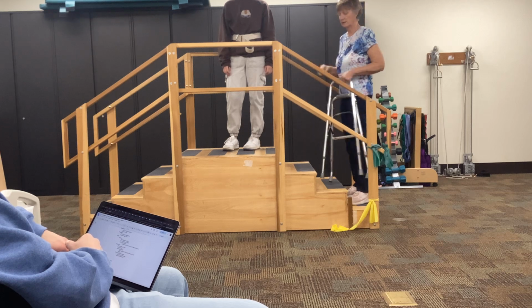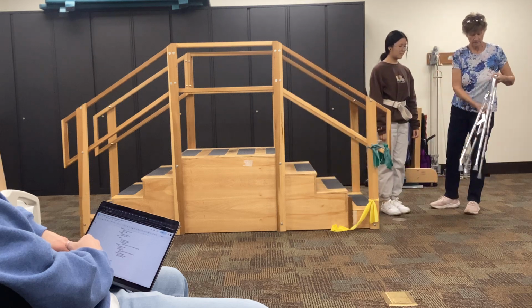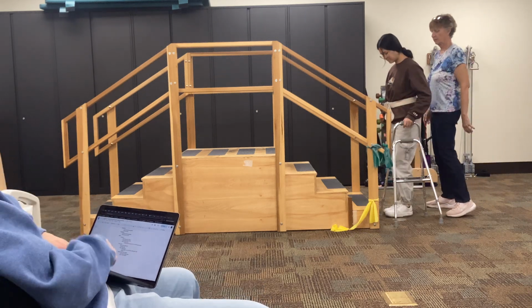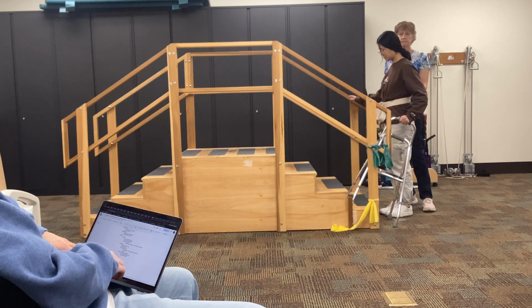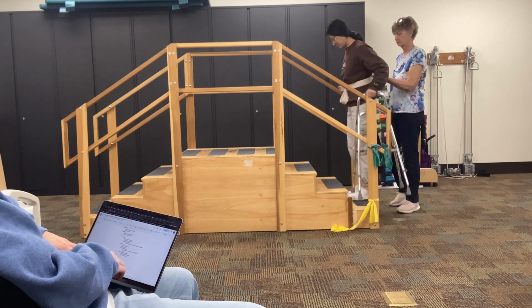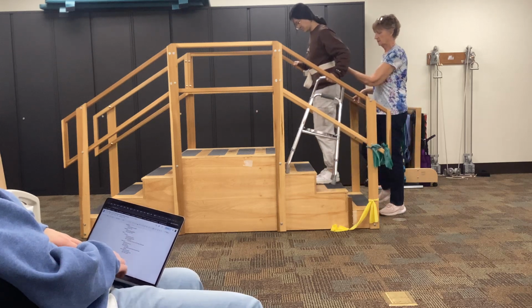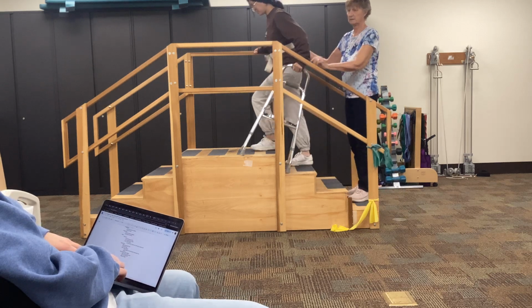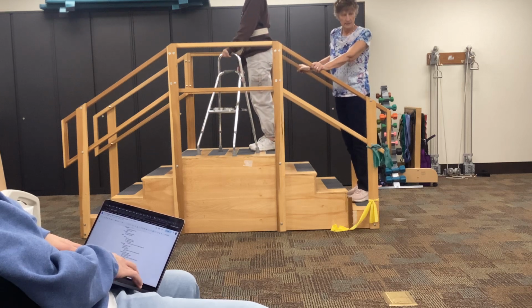Better way to do it with this, you can come on down, would be to have them go ahead and do it the way you were doing it. But what should I have her do? Pull her out. So then she can put more pressure through the railing and rely a little bit less on putting pressure through here. Would you still want their weak side against the railing, or would you want them to hold?